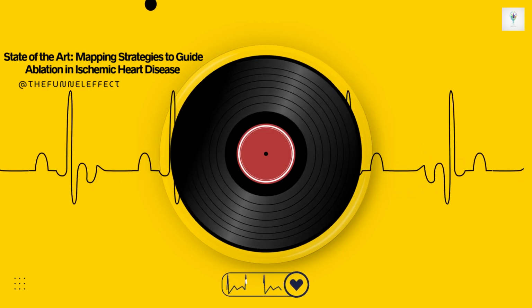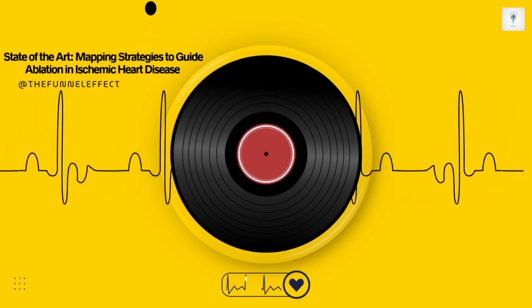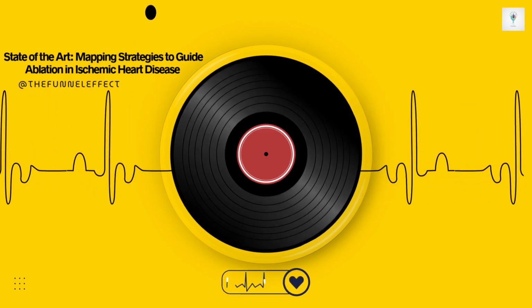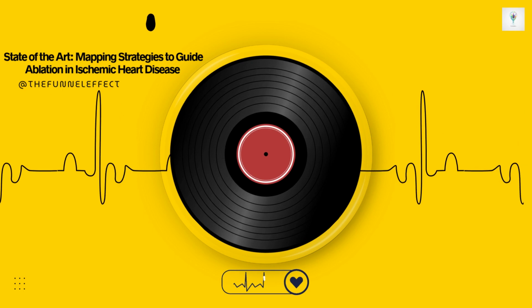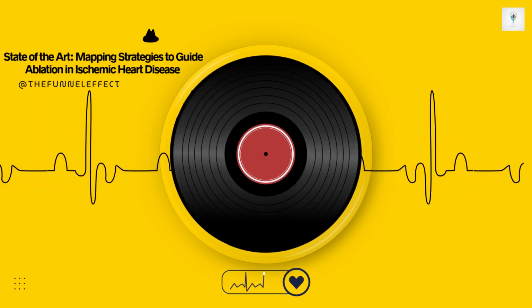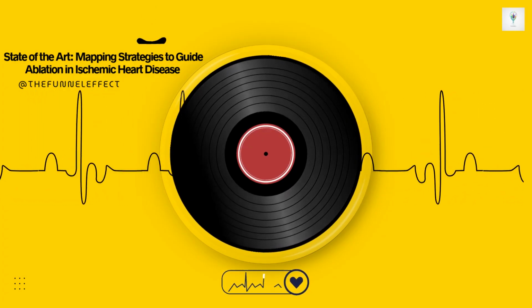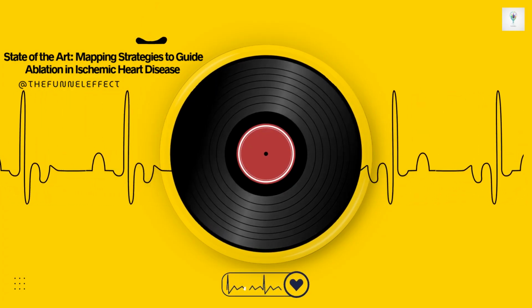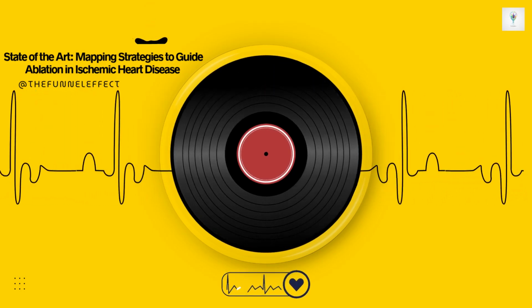Wow. But the source rightly points out that while sometimes necessary, using these pumps isn't without risk either. It increases the chance of vascular complications. It just underscores how high-stakes mapping during VT can be. Assuming you can keep the patient stable enough, let's talk about the first technique, activation mapping, trying to follow the wavefront in real time. How do the mapping systems cope with the speed and the messy signals in scar tissue?